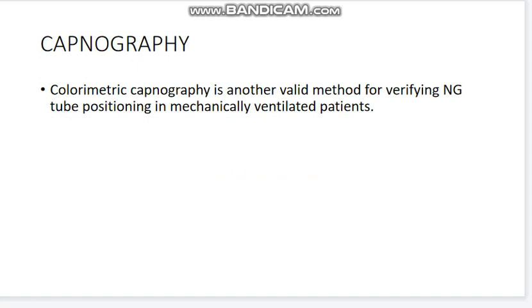Colorimetric capnography is another valid method for verifying NG tube positioning.